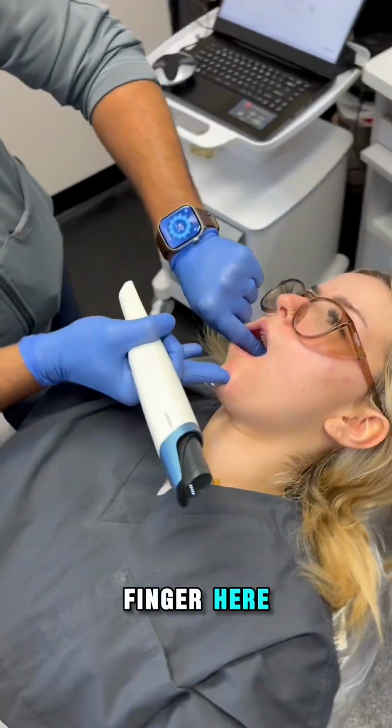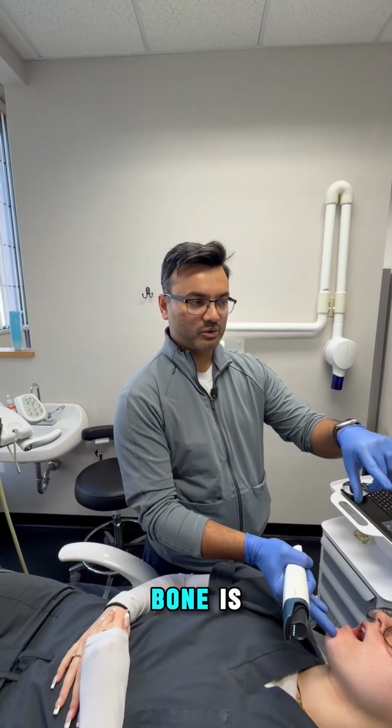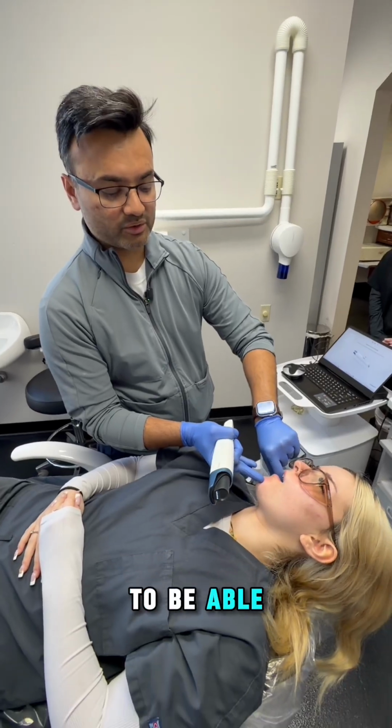I'm going to put one finger here so you can feel the mandible. That's where what I call tactile sensation, feeling matters. So feel it, feel how the bone is. Don't have long nails so that you're poking the patient there. Be gentle, be very easygoing with the patient, but you need to be able to feel.